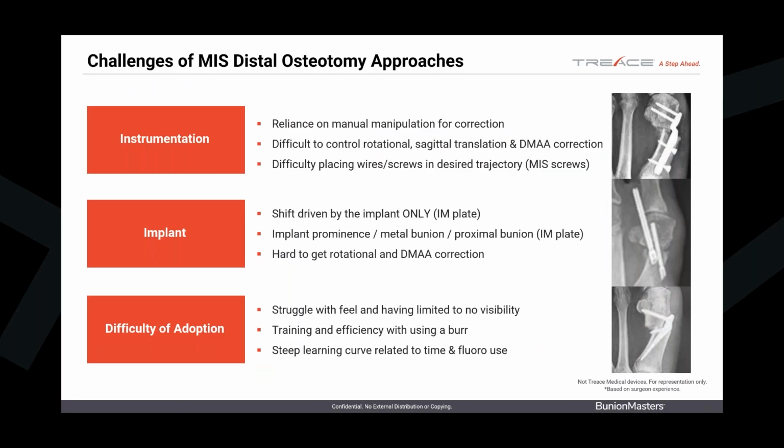So what have been the challenges in MIS? I mean, I've seen them all. I started at the very beginning. I had to do freehand. I've watched the instrumentation come through. So I am not novice to this. I have been able to participate and help companies with kind of changing this in the direction. But one of the problems has always been instrumentation. At the beginning, there wasn't instrumentation, so we had to rely on freehand and manual correction, which is hard, and that's where the high learning curve comes in.